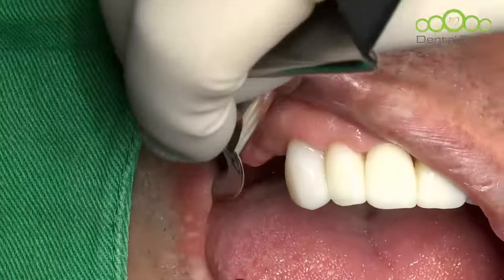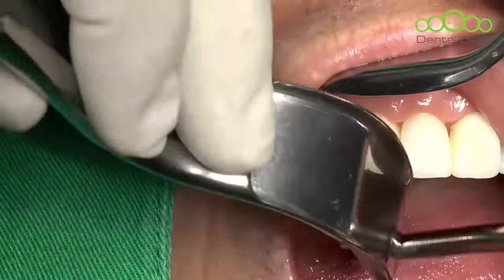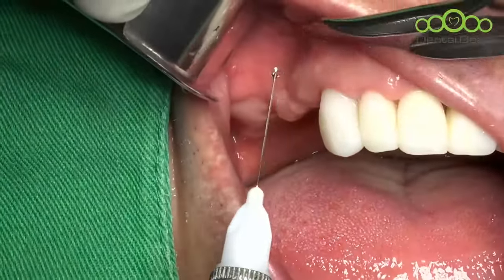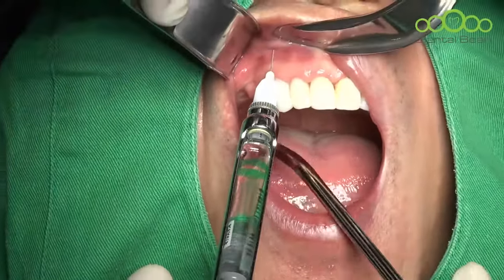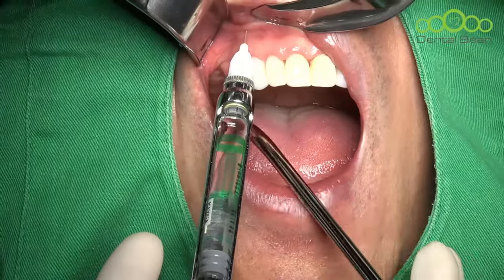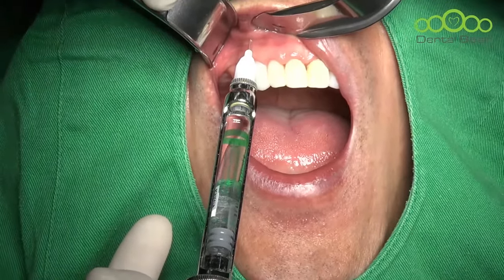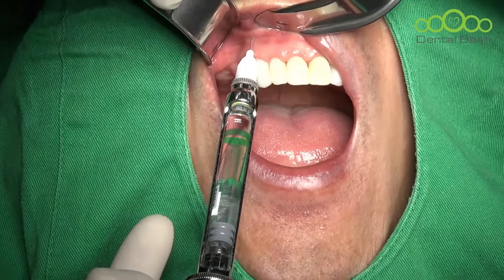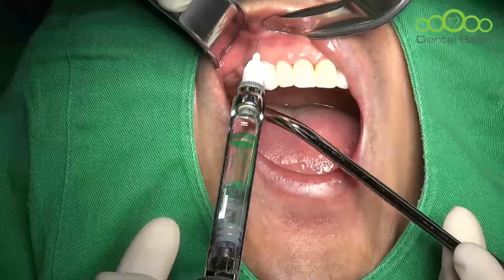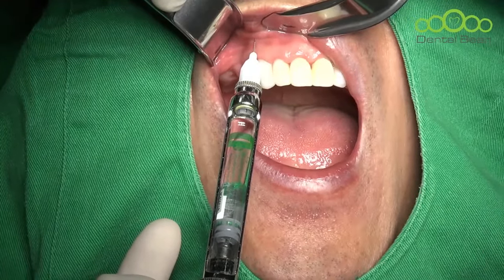Change the video. Okay, I'll start with the anesthesia. Usually, we can easily finish anesthesia on the maxilla just with infiltration or block anesthesia. Everything is easy to finish. So usually I spend two ampules for one side.